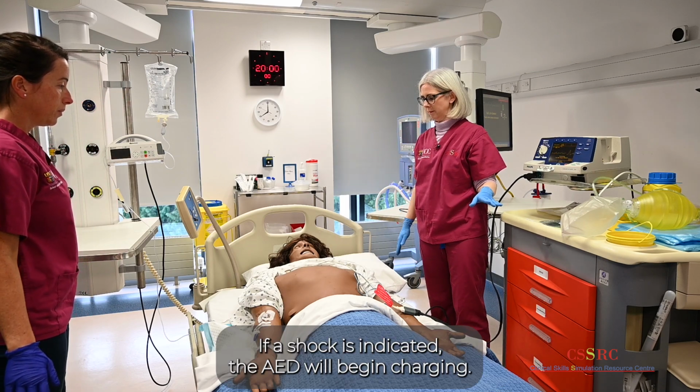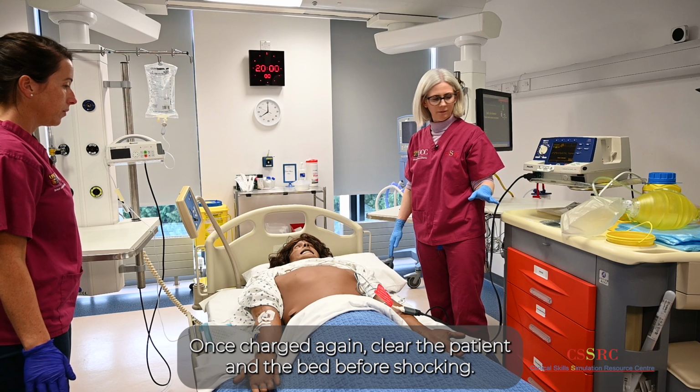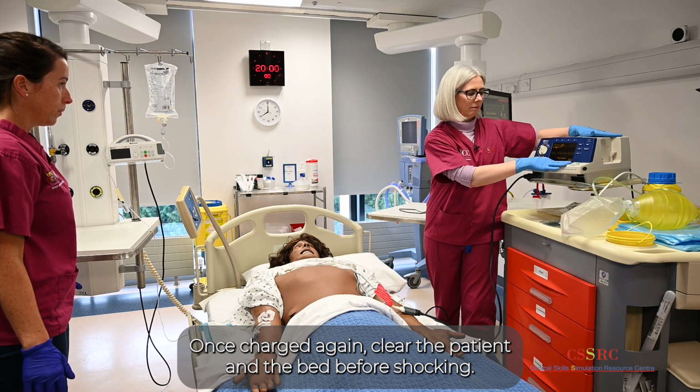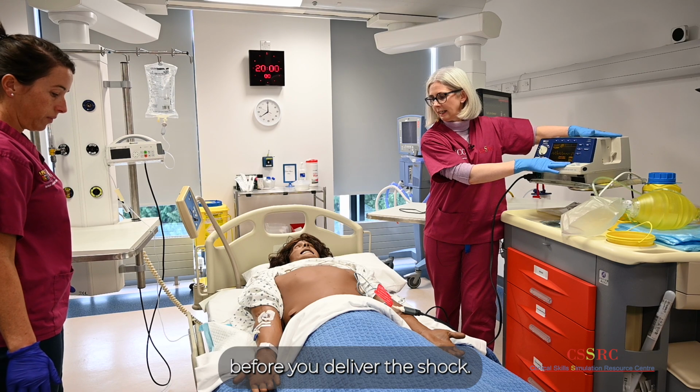If a shock is indicated, the AED will begin charging. Once charged, again clear the patient and the bed before shocking. Ensure you are looking at the patient and ensure all present are clear before you deliver the shock.